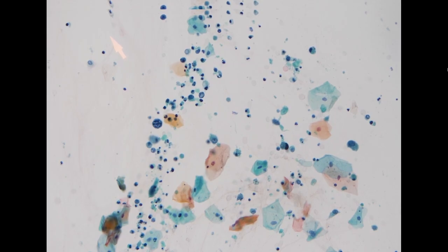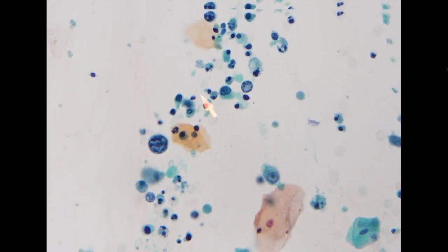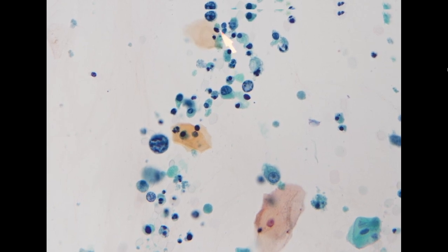And here we start to see some highly degenerated but atypical cells. In the background, there are a few necrotic type of cells, so these can be due to degeneration.